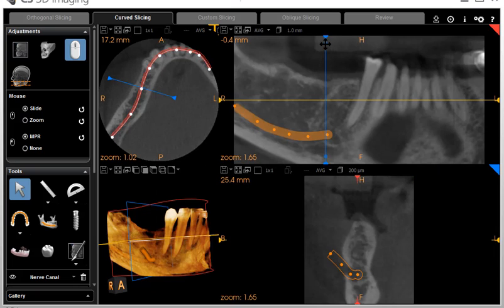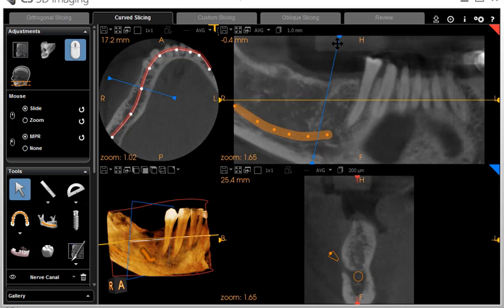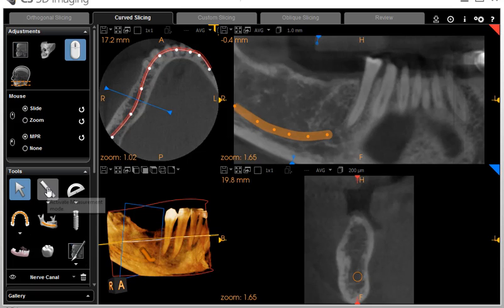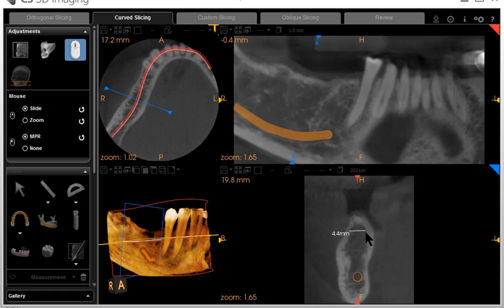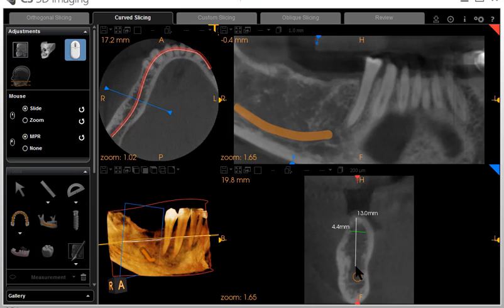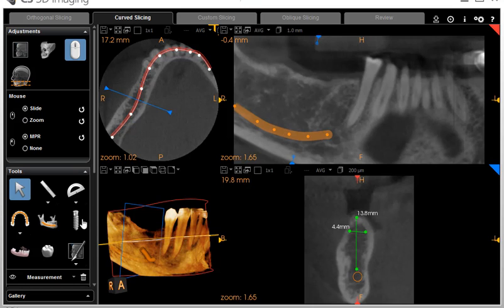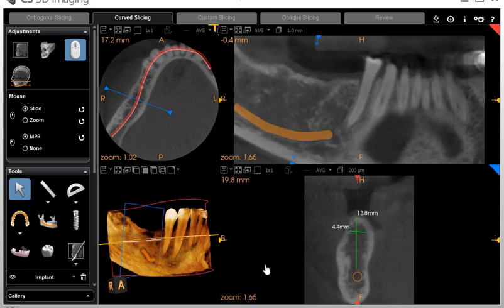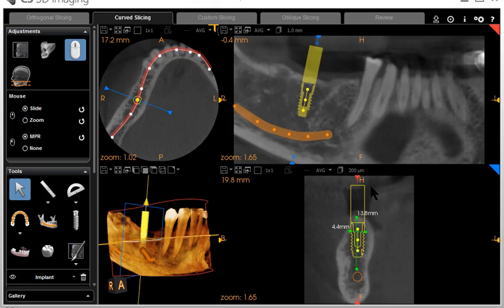Now I'm going to place an implant. This blue line is where you're going to place the implant, so you can move it back and forth. Let's say we're going to place an implant there. If we want to measure, this is the measurement tool. We can see that between the cortical plates we have about four millimeters. We'll do it again from the crest of bone to the canal — in that area you have 13 millimeters. So now we'll go to the implant tool. We'll pick an implant — this one here — and say okay. It places the implant where that blue line was.